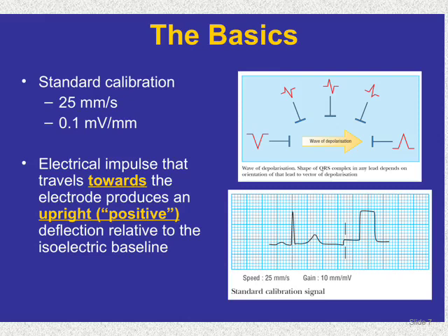The second important concept in the ECG is the term of the ECG leads. What do we mean by ECG leads? The ECG lead means the electrode of the ECG which looks at the heart from one different direction. In Arabic we call it متجه, meaning how we look at the heart from which portion, in the vertical plane or on the horizontal plane. So we have 12 leads, 6 limb leads and 6 chest leads.